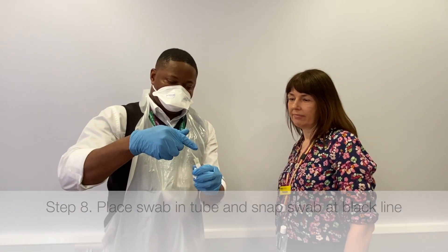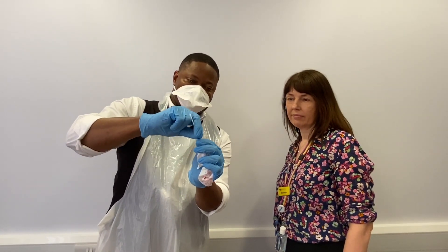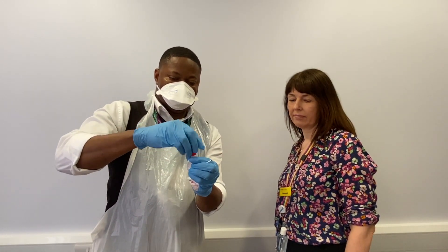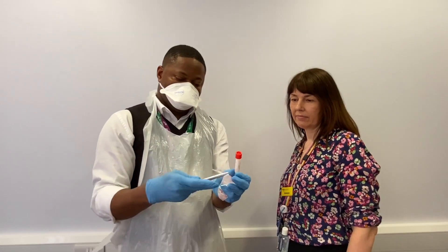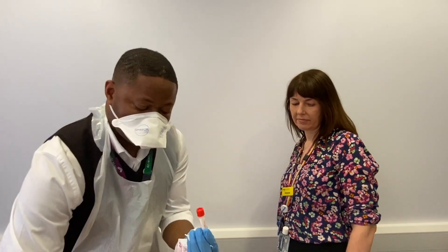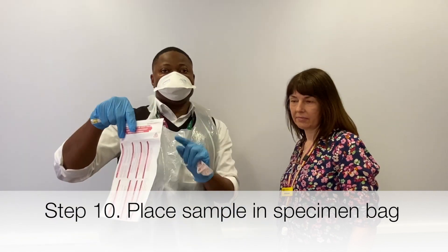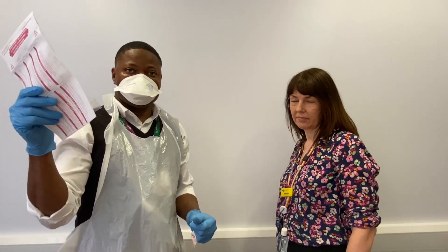If you open this carefully you can stick the swab in there. You need to hold it where there's a black stripe on it and just snap it that way, then seal this off. It's very important to immediately put the name of the patient on it once you've done that — so I'm going to put here: Vanessa. You need to do this twice, so you need at least two samples. Now the specimen bag, which has already been filled in by your doctor — you put this nicely into the specimen bag, and then this is where it goes into virology.